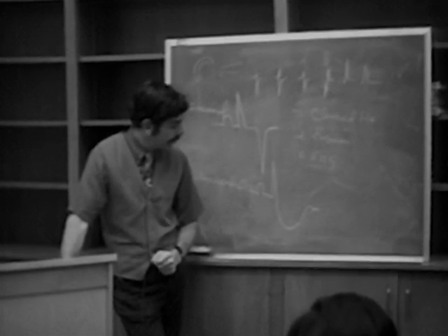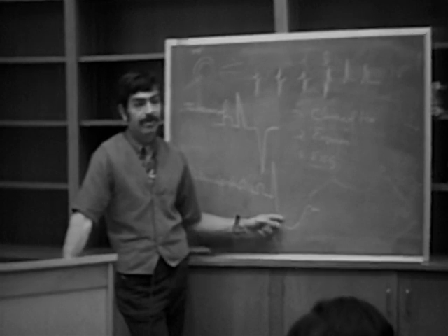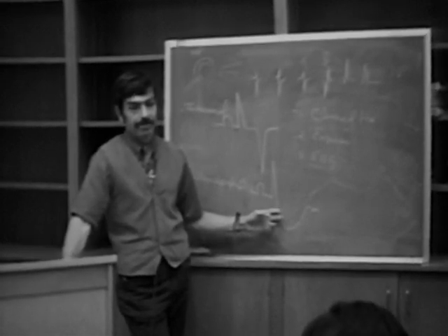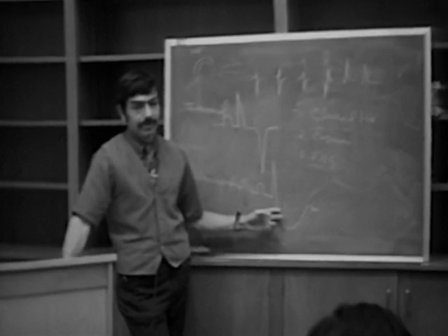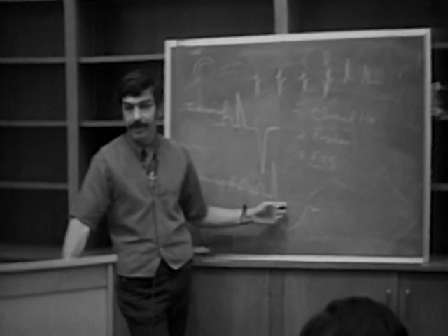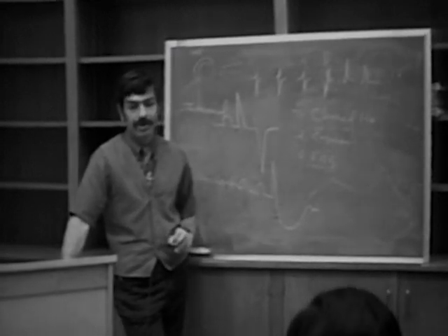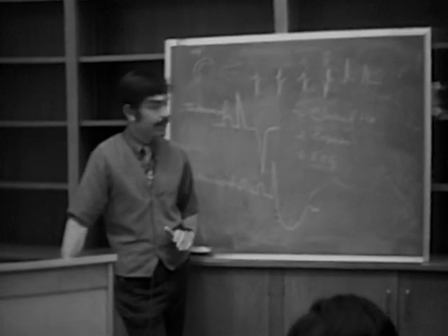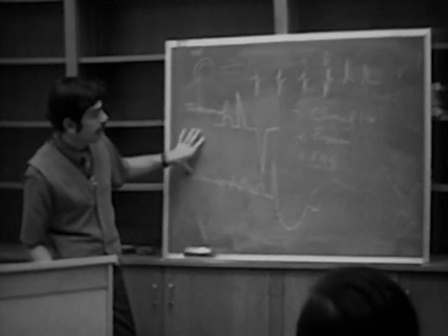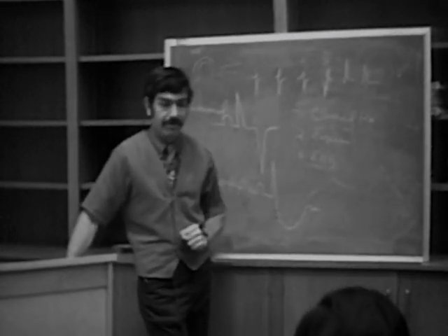a good blood supply. Now, if the patient's on digitalis and you've never seen an EKG on him before, this diagnosis is very much in question from an electrocardiographic standpoint. Right? You just don't know. However, if the patient's been on digitalis before and has had a different pattern, and then has changed to this pattern, then you feel a little bit more confident about the diagnosis. But the major point that I'm trying to make is that in intramural and subendocardial MIs, your EKG is not as good, and you have to rely on all the criteria you have available.